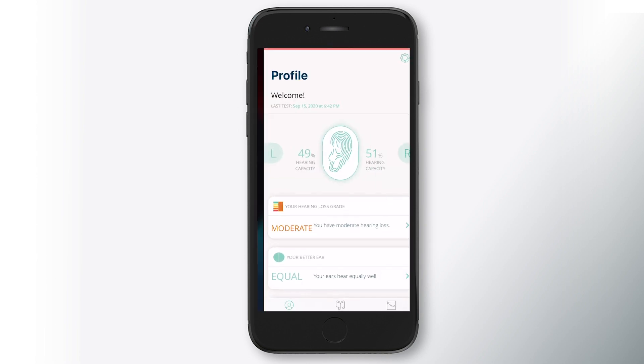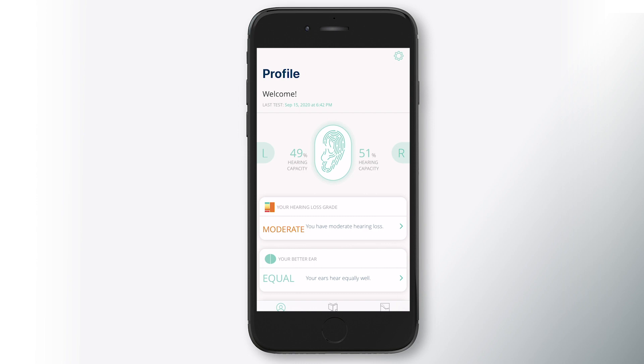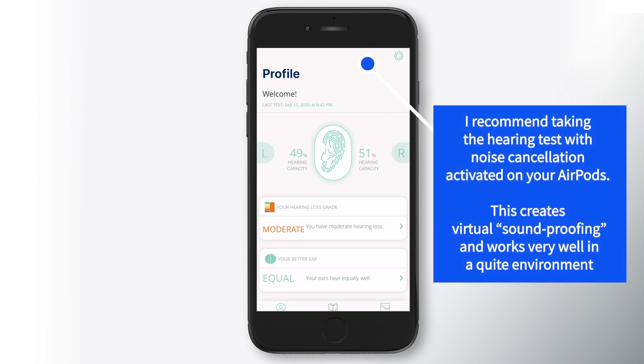Once Meme is configured and you've gone through the hearing test, you'll walk through and get the test results and all that. But a few things about this. If you do the hearing test, I personally recommend I got the best results with the silicone tips with noise canceling turned on. And of course, you need a quiet environment. So I got the best result with noise cancellation on.